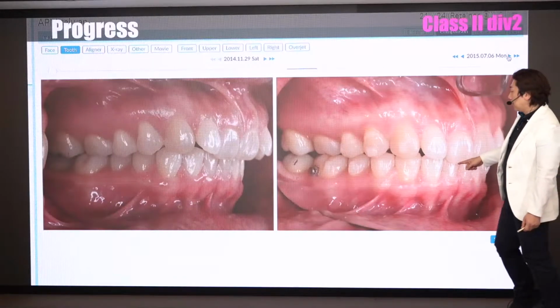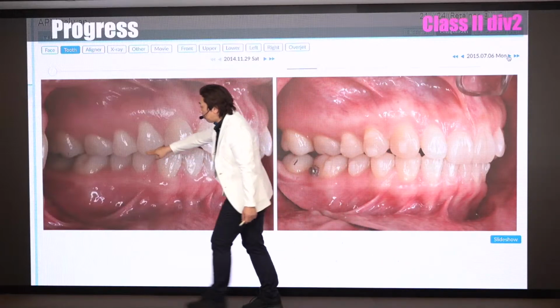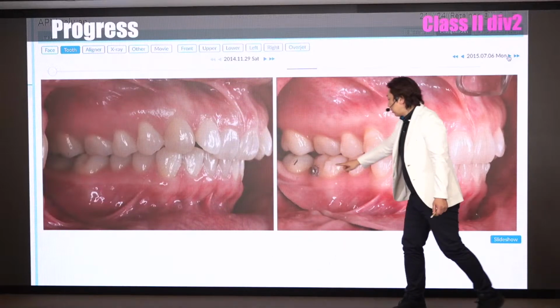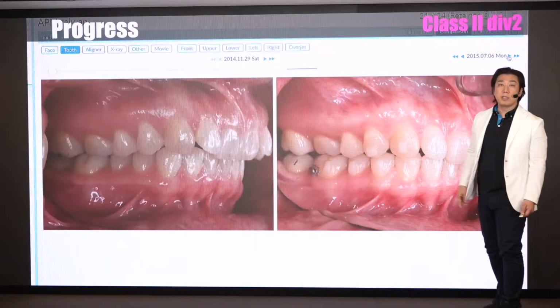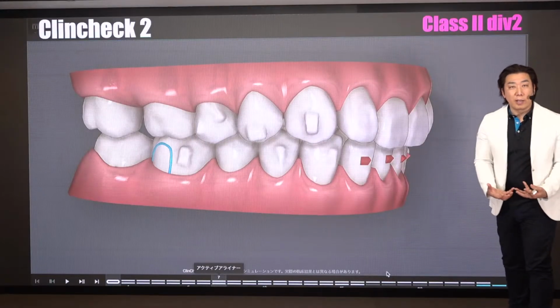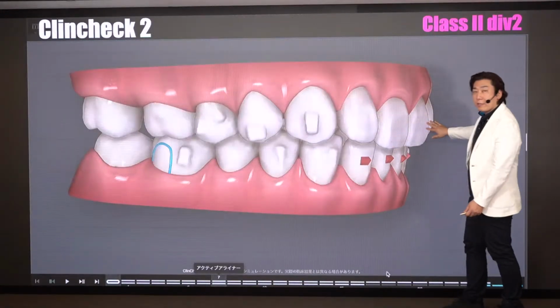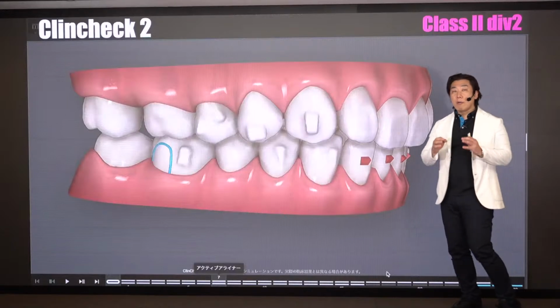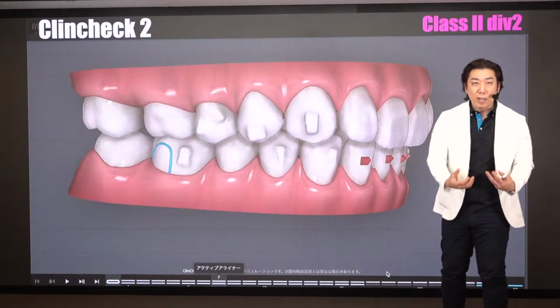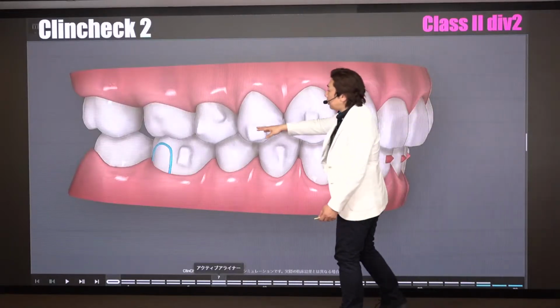Different. The canine position is already different. This is class 2, molar side class 2. But this is already edge to edge, right? Then re-scanning again, because the axis of the upper anterior teeth is already good. Then we have to check by re-scanning again, then analysis, take a further treatment planning, then start to distalize the upper molar.